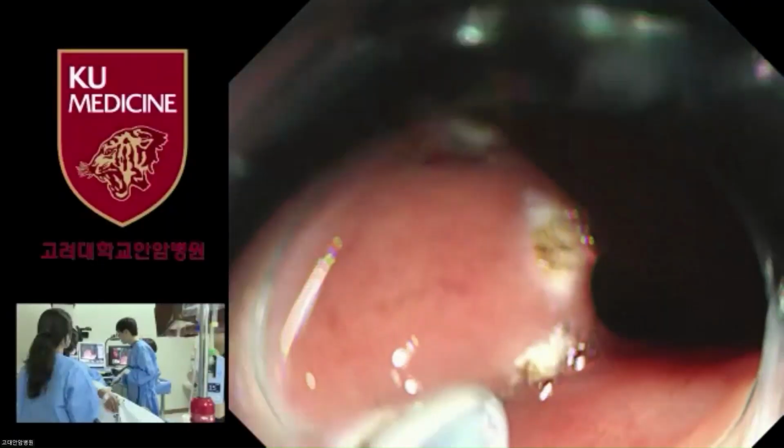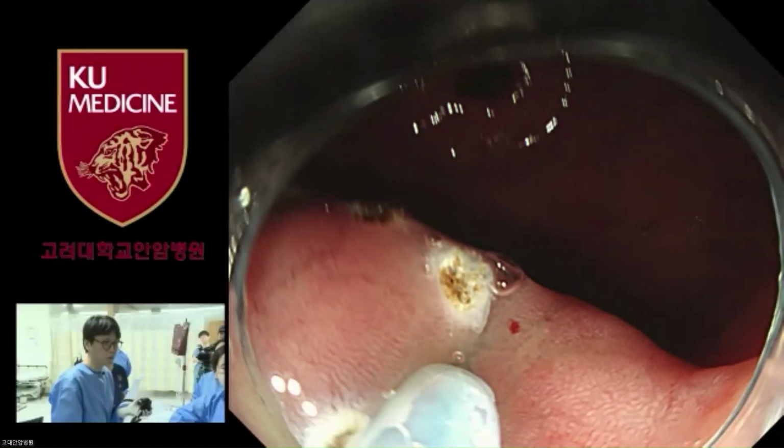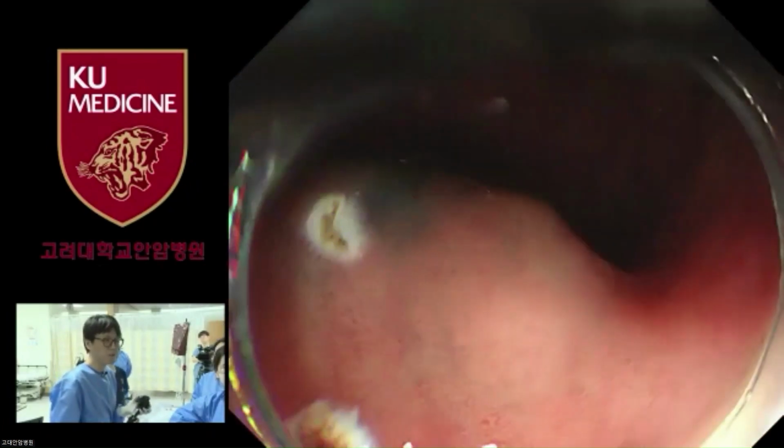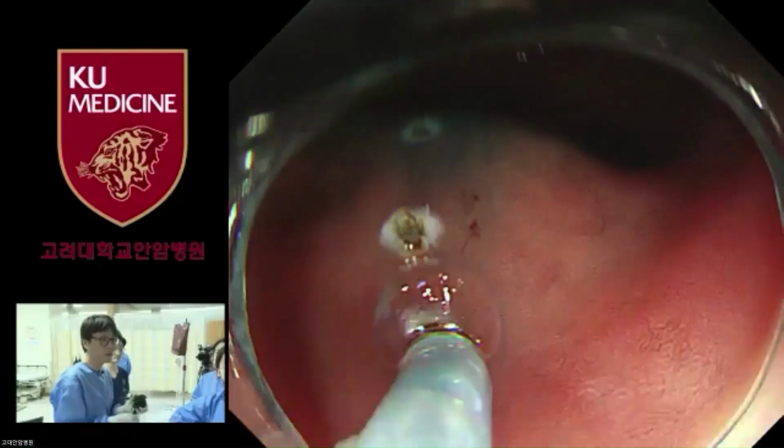What is the injection solution for this? Now I'm using a 1-to-1 mixture of normal saline and 0.4% hyaluronic acid solution. Normal saline plus hyaluronic solution? Yes. A mixture, okay.